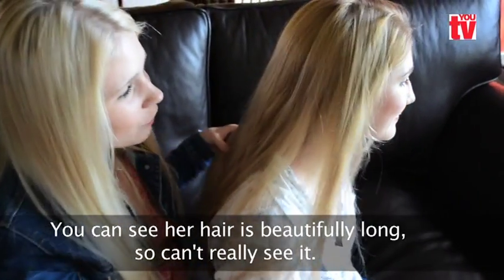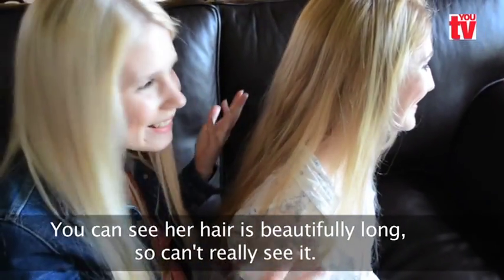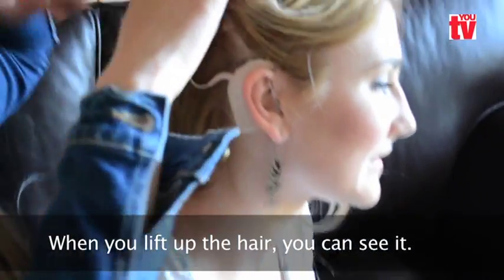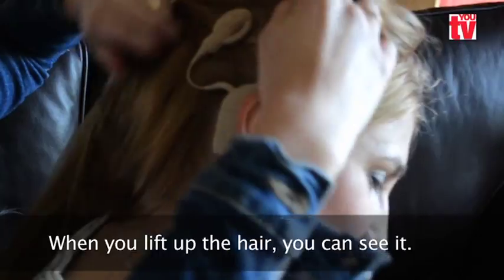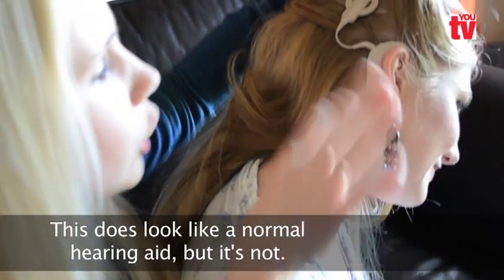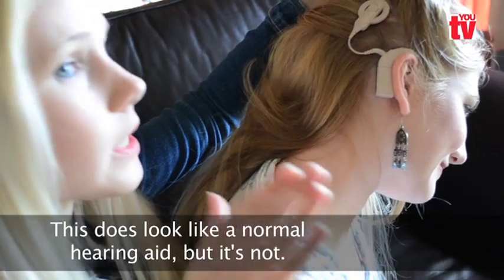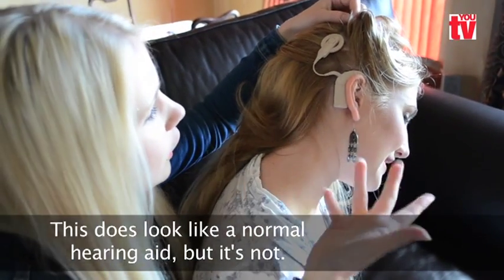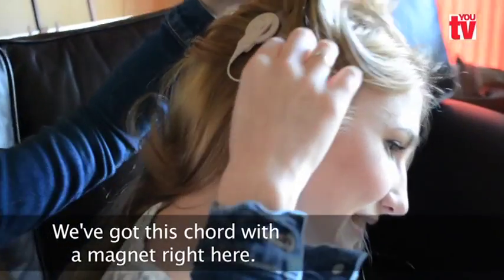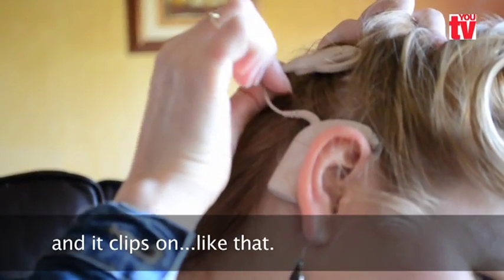You can see it on her. So if you look here, you can see it. This looks like it could be a normal hearing aid, but it is not a normal hearing aid. And you can see that because we have got this cord with the magnets right here. And if you take it off, it just pops off and clips on like that.